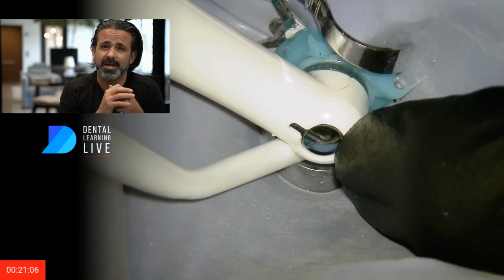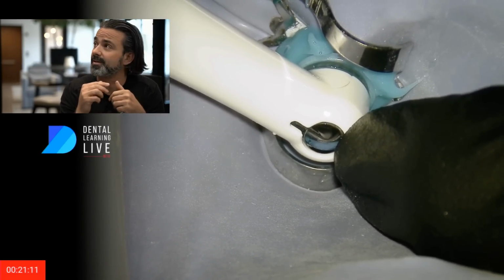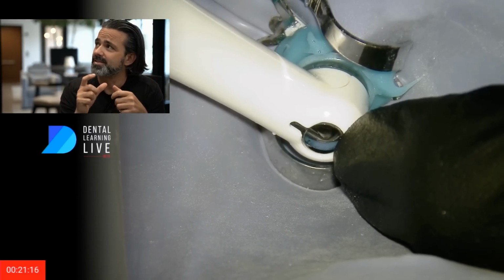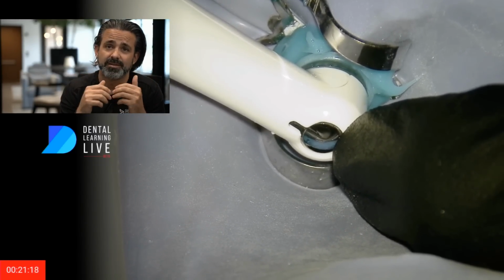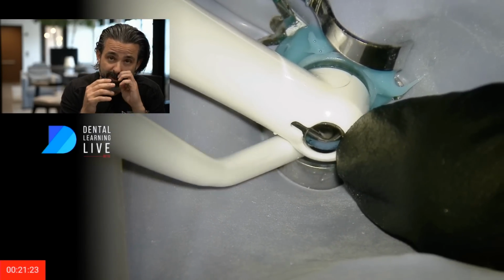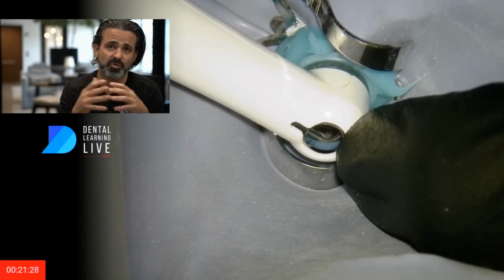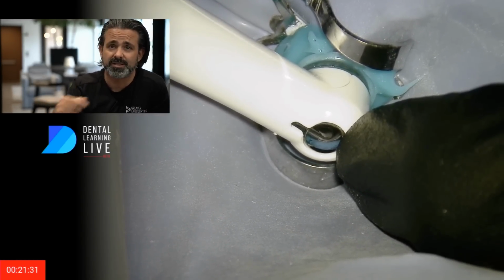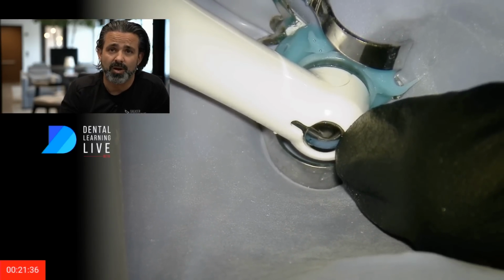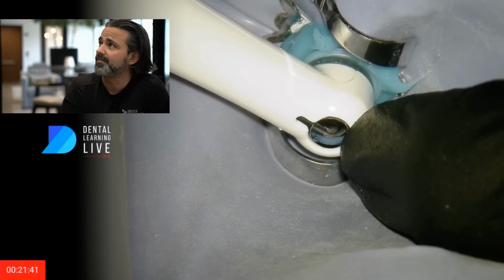When I do root canals, I'm really trying to keep a protocol in my mind, and I work in a philosophy of eights. I know that makes no sense right now, but I divide this up into 4 steps in my mind: the pre-work with decay removal, then access and the GentleWave, then the restorative phase. And I like to do them in 8-minute increments. Those are my goals. I don't want to rush through it, but I want to always maintain my schedule and be really conscious of what's going on in my office.